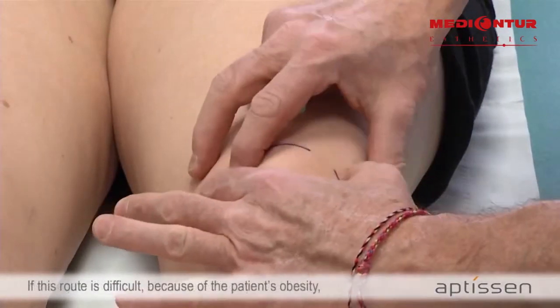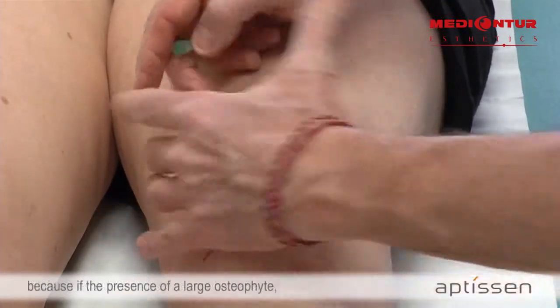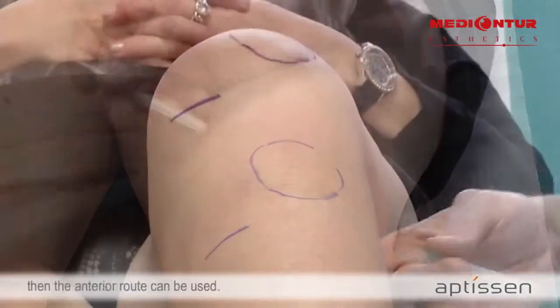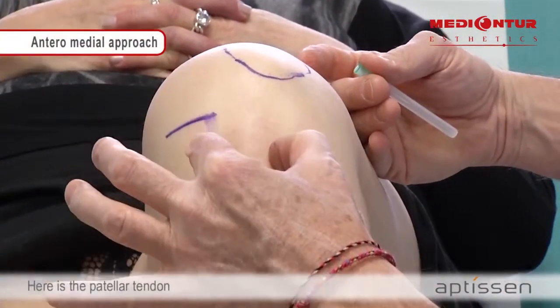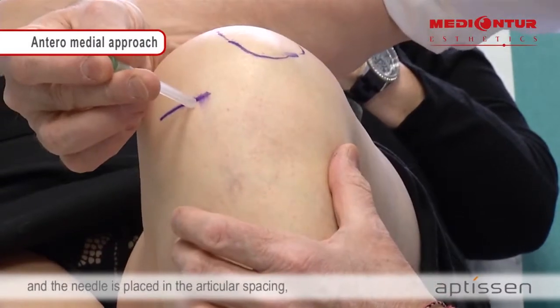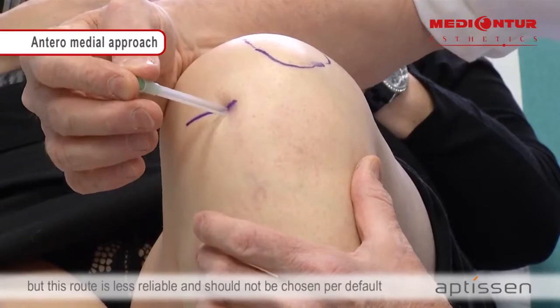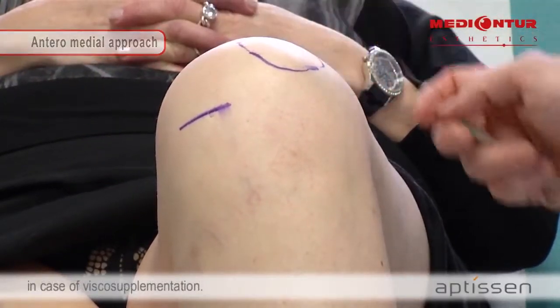If this route is difficult because of the patient's obesity, or because of the presence of a large osteophyte which prevents underpatellar access, then the anterior route can be used. Here is the patellar tendon, and the needle is placed in the articular spacing. However, this route is less reliable and should not be chosen by default in case of visco-supplementation.